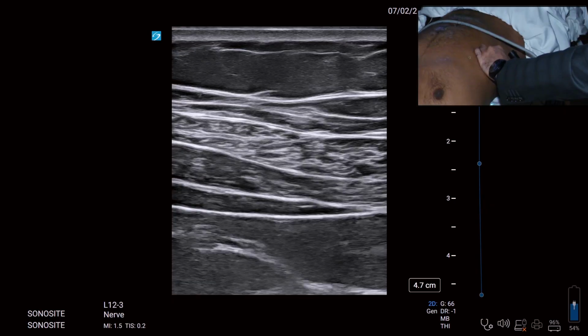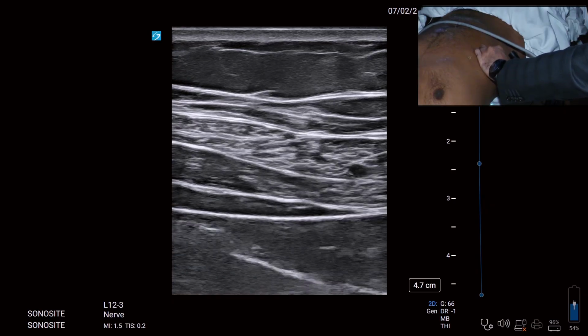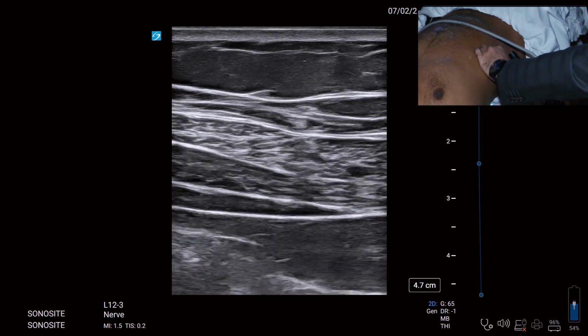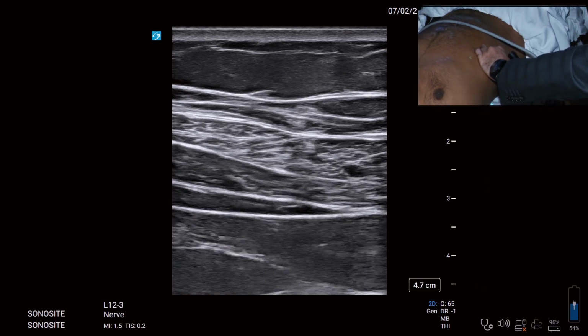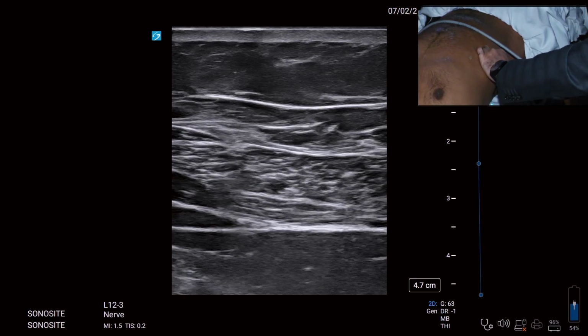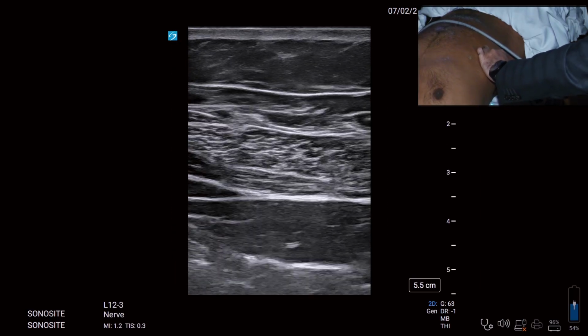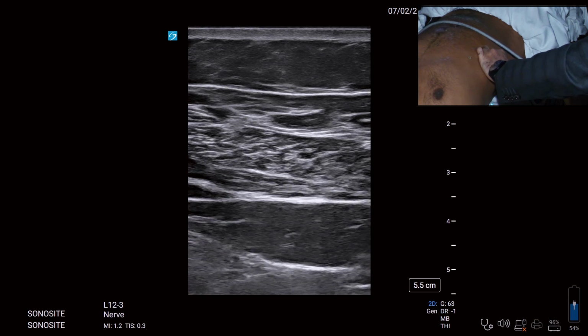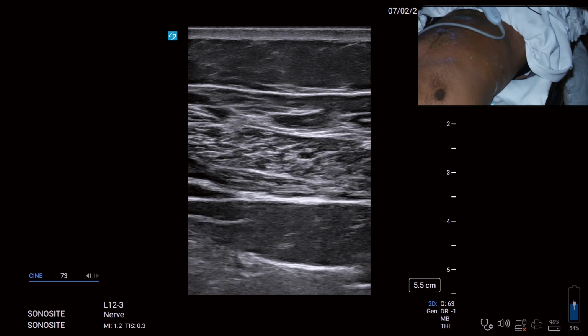And we should be going as posteriorly as possible with a hope to catch the lateral cutaneous branches of the thoracoabdominal nerves between T10 to L1. Is it clear? If I go more posteriorly, my dear friends, and increase the depth, can you see the white hyperechoic line? Can you freeze it? Okay. This white hyperechoic line represents the common aponeurosis from the internal oblique and the transversus abdominis.